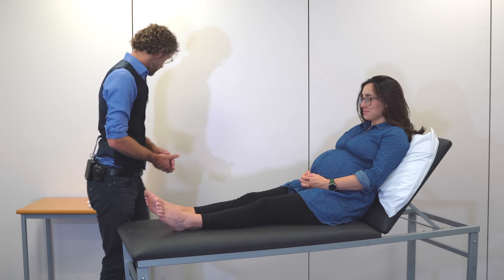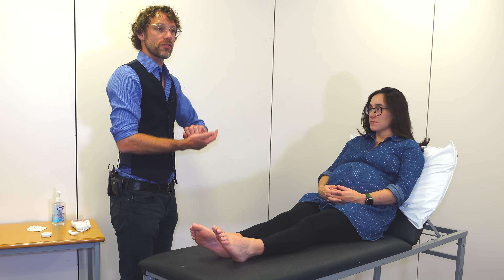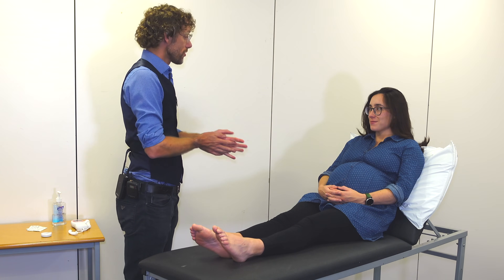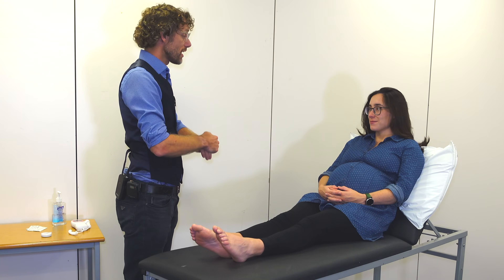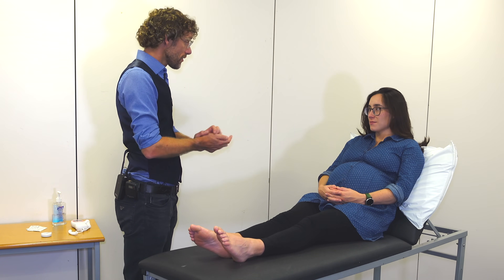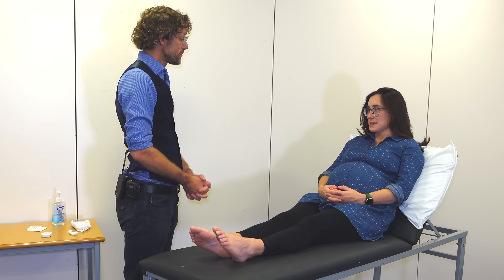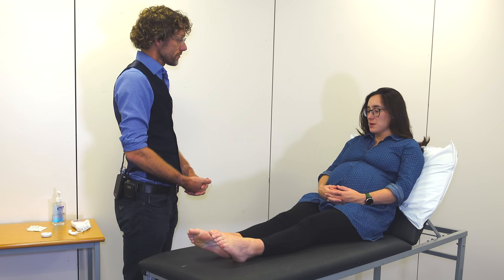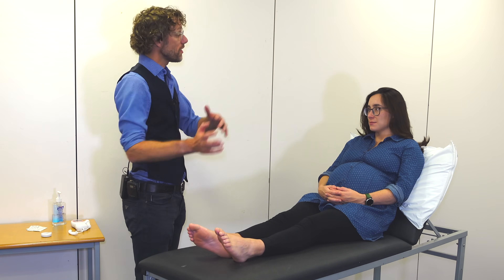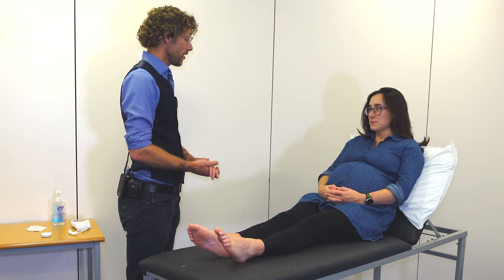To start off, we want to make sure we gel our hands and introduce ourselves, confirming the patient's date of birth. Hello, my name's Dr Gill. I've been asked to do a symphyseal fundal height examination — we're going to be looking at how the baby is growing. Before we go any further, could I please confirm your name and date of birth? It's Bethany Gill, date of birth 10th of August 1993. What this is going to involve is getting you to lie flat and putting the ultrasound probe on your tummy to listen to the baby's heartbeat.